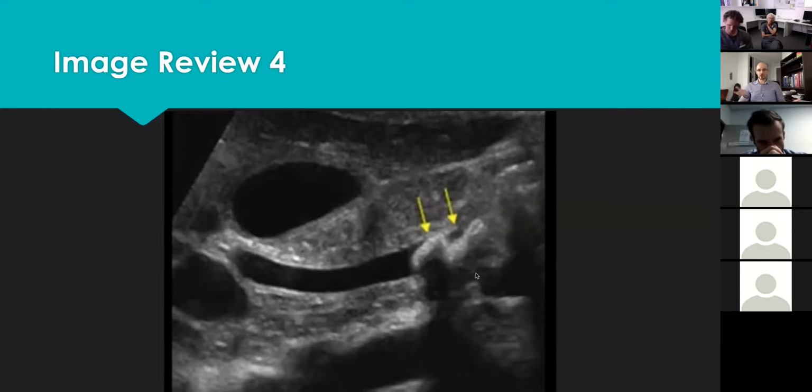Did you try in supine position or put the patient in pretty much a 45 degrees lateral position? In ICU, it's always like 30 to 40 degrees, kind of thing. To be honest, it can be very, very hard. Other than changing the position, I assume most of your ICU patients cannot take a deep breath in and hold, unless they are intubated, then you can do it for them. There's not much else you can do technique-wise.